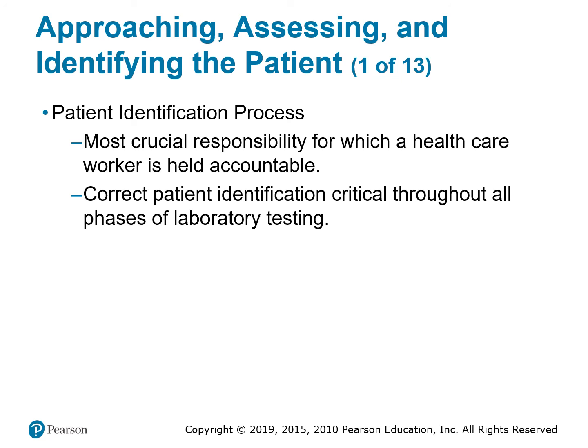What is the patient name? Double check the patient identification by re-saying the patient's first name, last name, and date of birth, making sure as we're sticking the labels on the tube itself. That is first and foremost. But another good thing is we're always the first ones to catch any possible mistakes in the patient's identification. So it's like a two-edged sword. It can make us or break us.